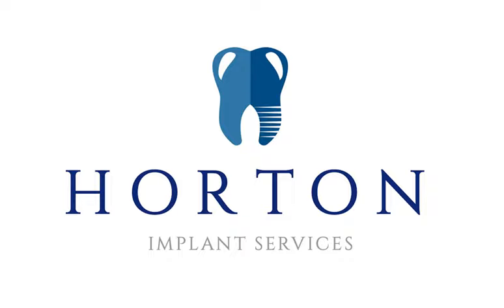It's an augmentation procedure, and we can use the patient's own bone, donated bone from another human, animal-derived bone, or synthetic bone, and they've all got their pros and cons in how they work. There's a discussion as to which one we use, which one the patient's comfortable with, and which one is going to achieve hopefully the best results for the situation that we're dealing with.